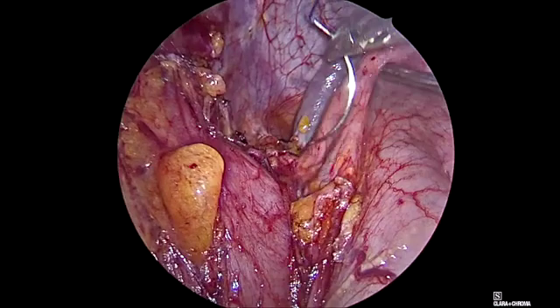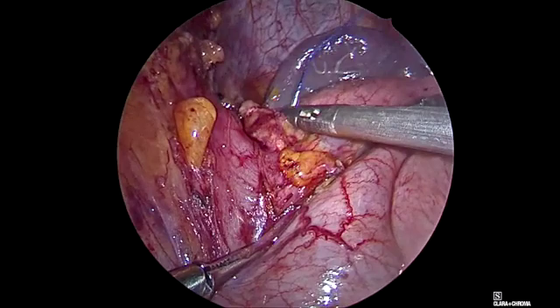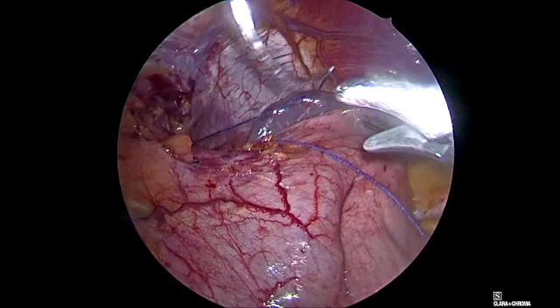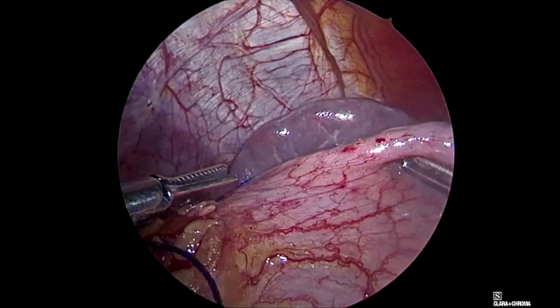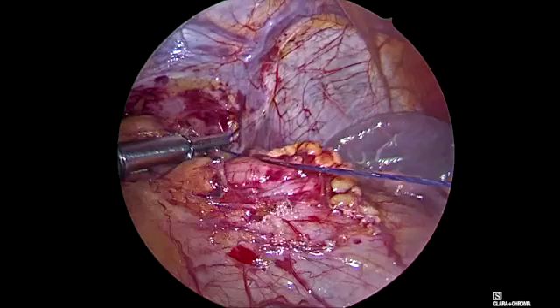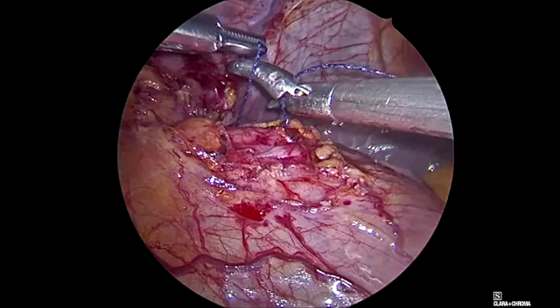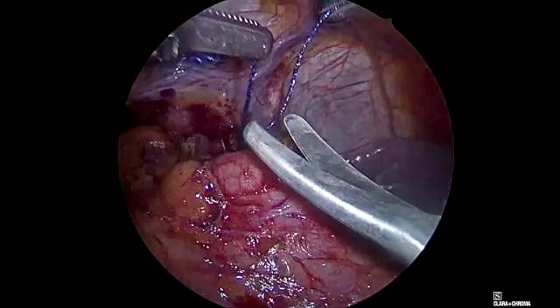We see it here. We want to maintain this area that contains the sling fibers, and in some way we reconstruct the angle of His. Additionally, this point will be a landmark guiding us during the stapling. We want to keep these sutures so the staple line will end at the side of these sutures. This helps us make our sleeves very homogeneous, because they always end at a predetermined distance from the gastroesophageal transition.